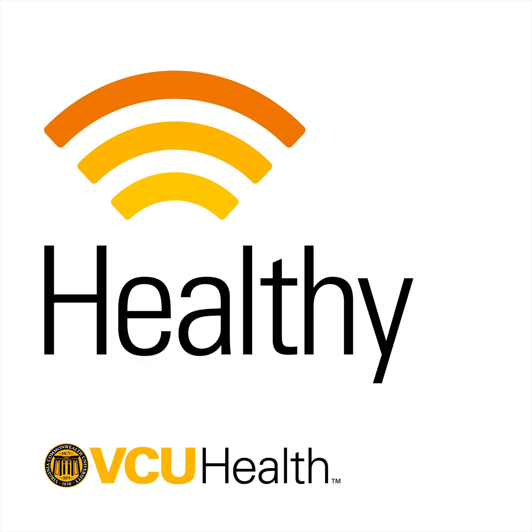You come in the morning, we get you changed into a hospital gown, and we give you a little bit of medication. So we give you some Tylenol to help with any headache that might occur during the procedure, and we give you medication to combat nausea, because sometimes people can become a little bit nauseated, although that is pretty rare. And then we have to shave your hair.